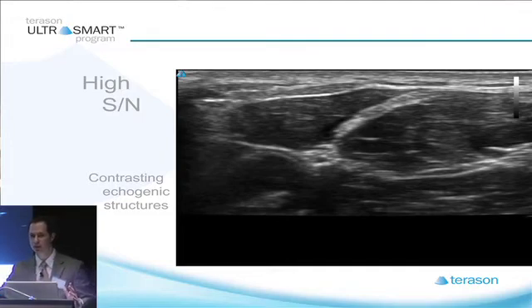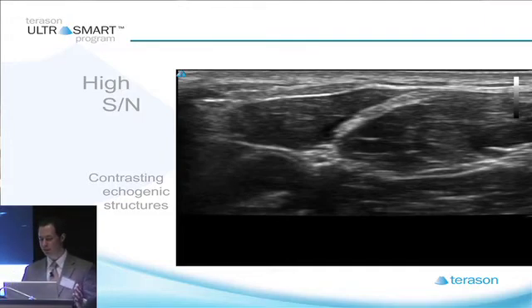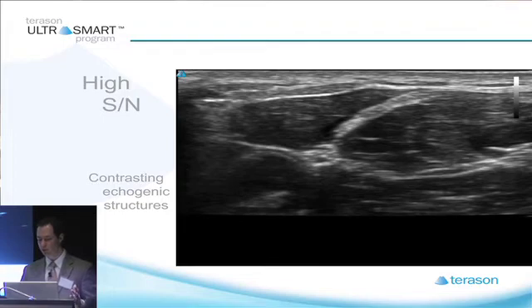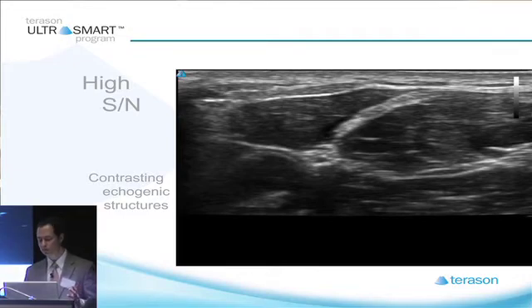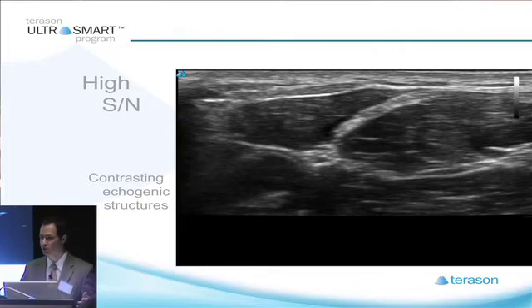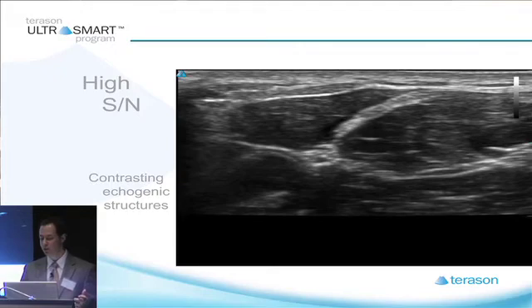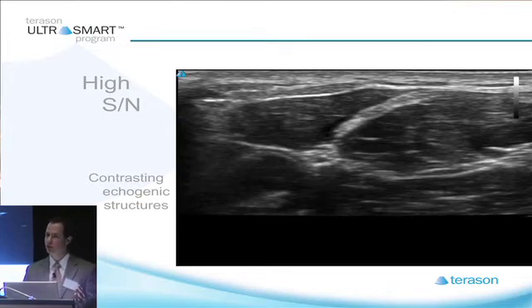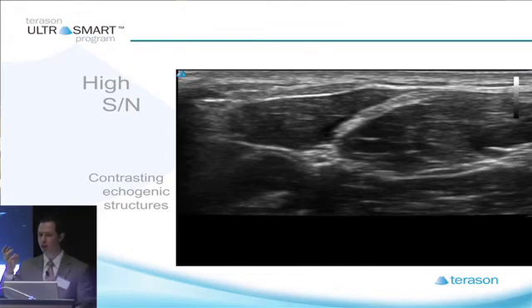Looking at the image on screen, you can see a dark triangular structure, another darker structure, some brighter structure, and a bright circle in the center — that circle is the median nerve. Sitting above the median nerve, in the darker areas, is the musculotendinous junction of the FDS, the flexor digitorum superficialis. You can see the median nerve so well because you have something dark against something bright — contrast in the picture gives you better signal visibility. More contrast means more signal, and this is a concept that will be very relevant later.